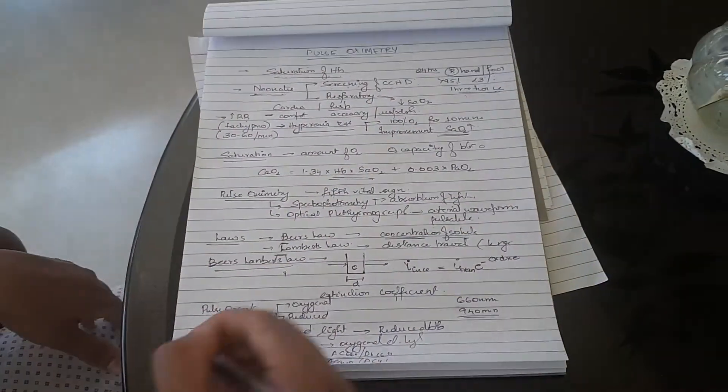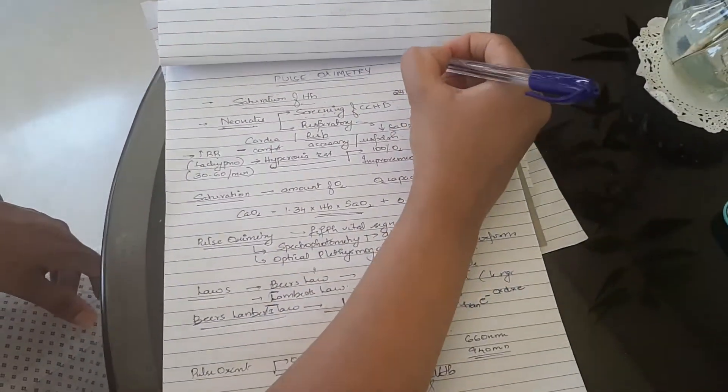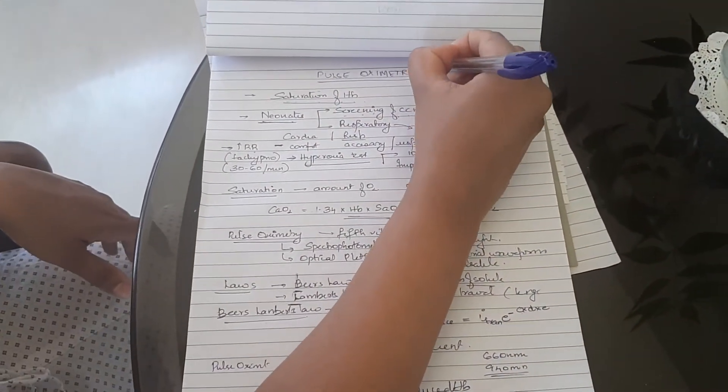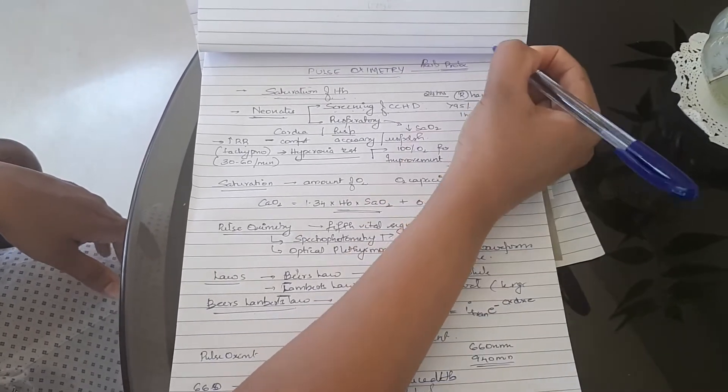So this is the basic idea of how pulse oximetry functions. Now what are the advantages? No, what are the parts? Parts of pulse oximetry: the probe which contains what?